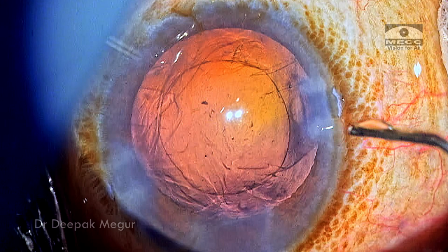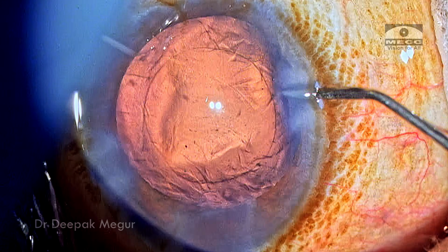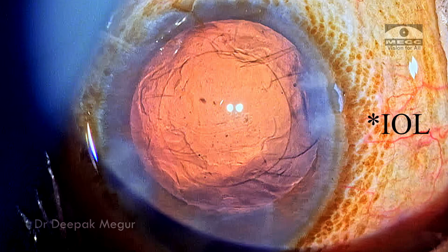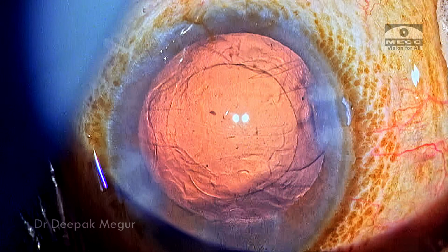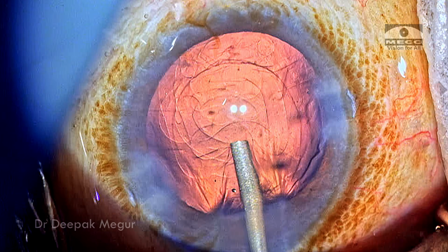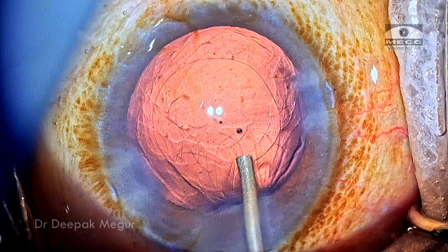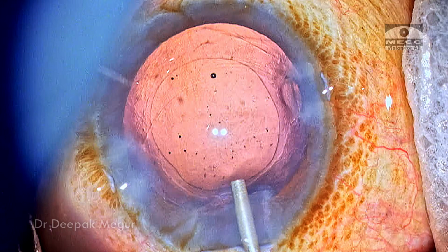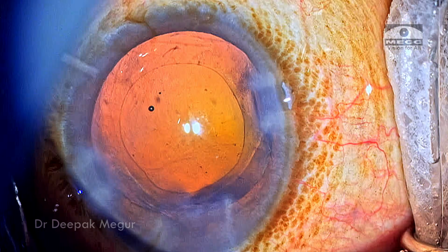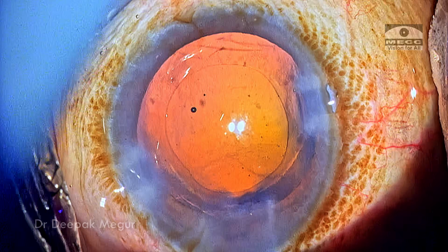Time to implant the lens, but at this point I'm wondering, should I insert the CTR now itself and then place the bag? The posterior capsule looked very thin and flimsy, and my concern was there an increased risk of rupturing the posterior capsule during insertion of the CTR. It was unlikely, but because the anterior zonules were quite healthy, I thought I could defer and see.